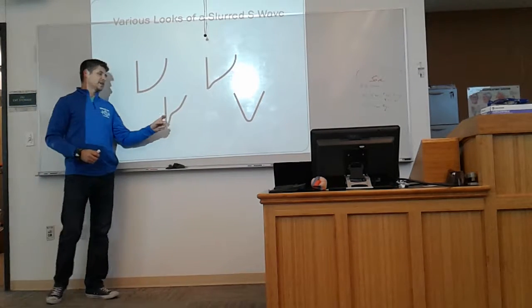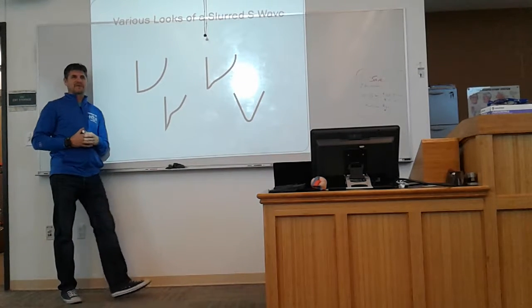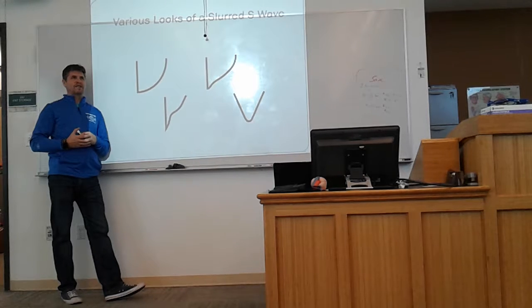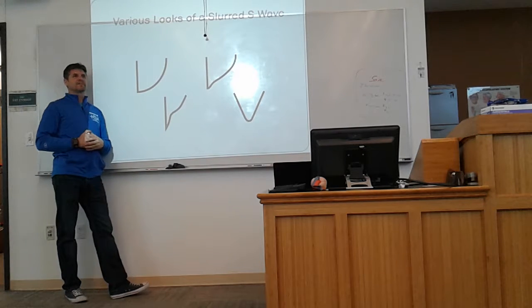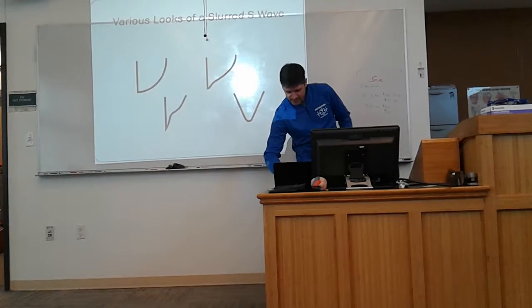And in fact, you need to make sure that you weren't calling this ST depression because it's not, right? Does that make sense? The S waves can have a lot of different looks to them. It's a slurred S wave. Yeah, this ends up being a slurred S wave. That's what we would call it. Correct. Does that make sense? Okay.